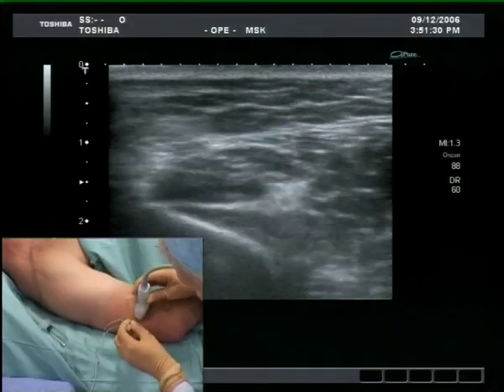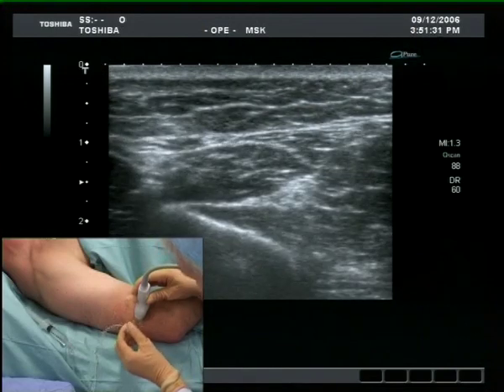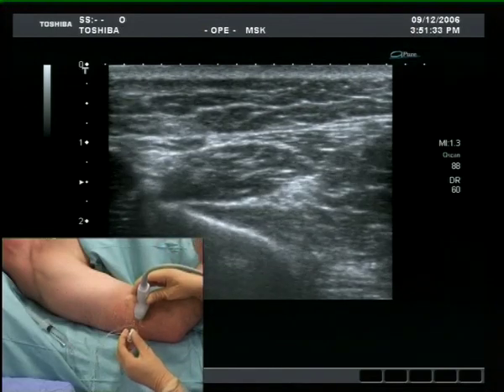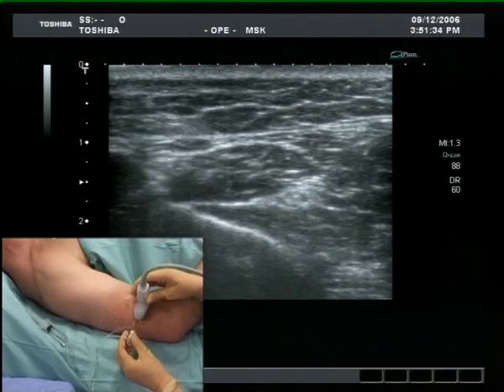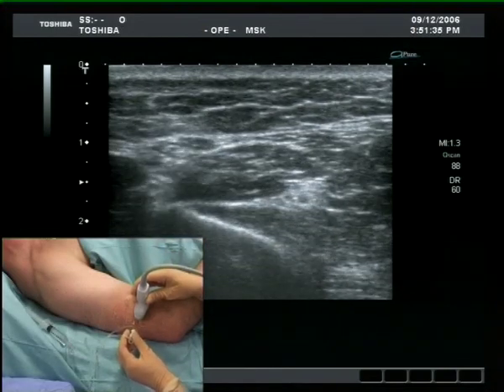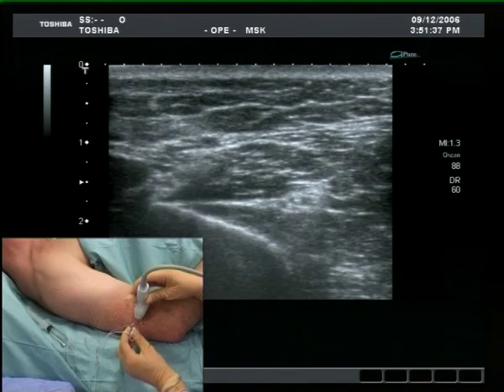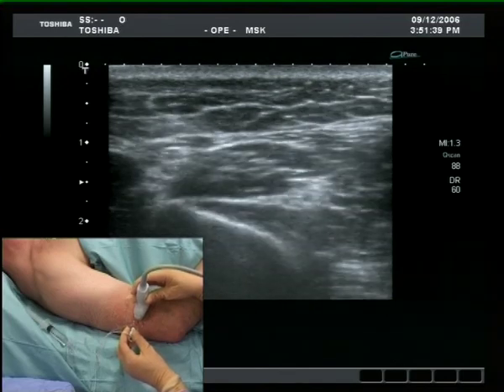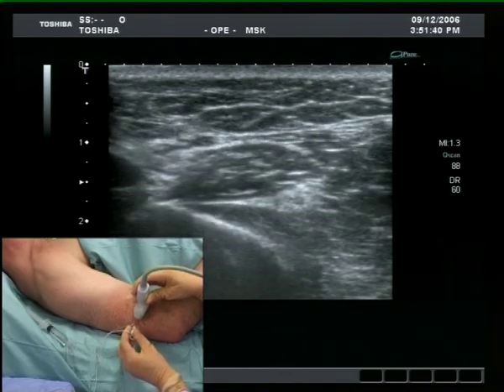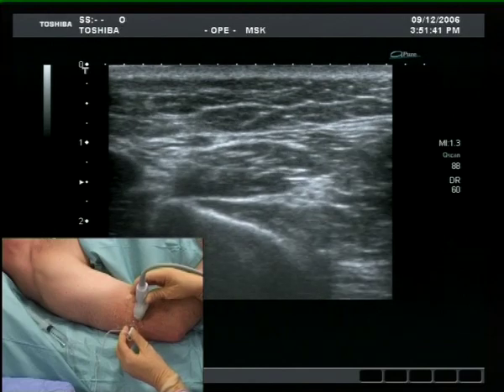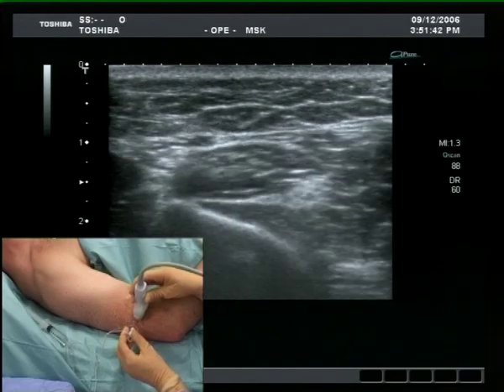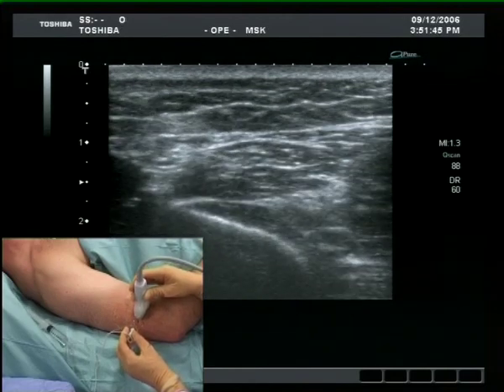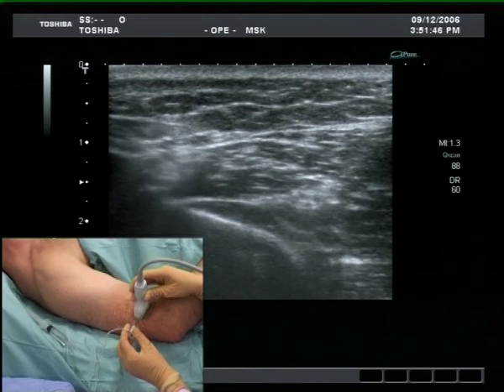In this clip, the needle appears from the left side. Small adjustments of probe or needle angle may be needed to allow needle tip visualization. The aim is to place the needle in the fascial plane, which is the white line lateral to the nerve.